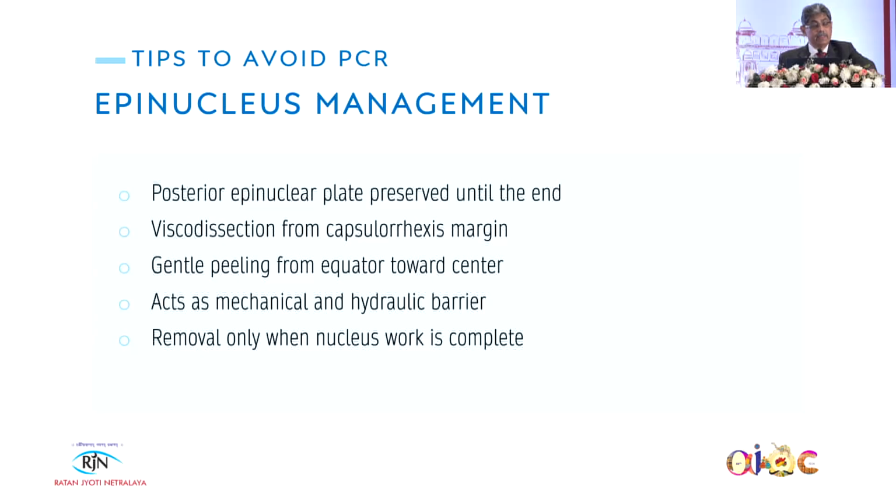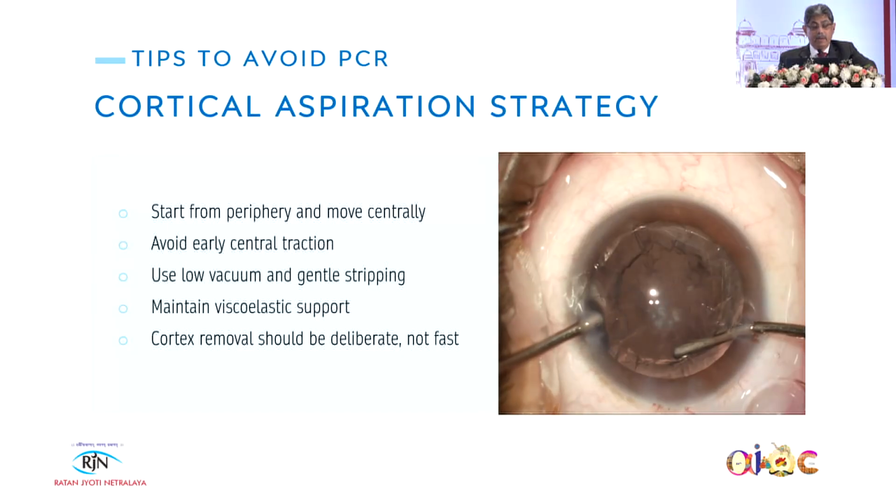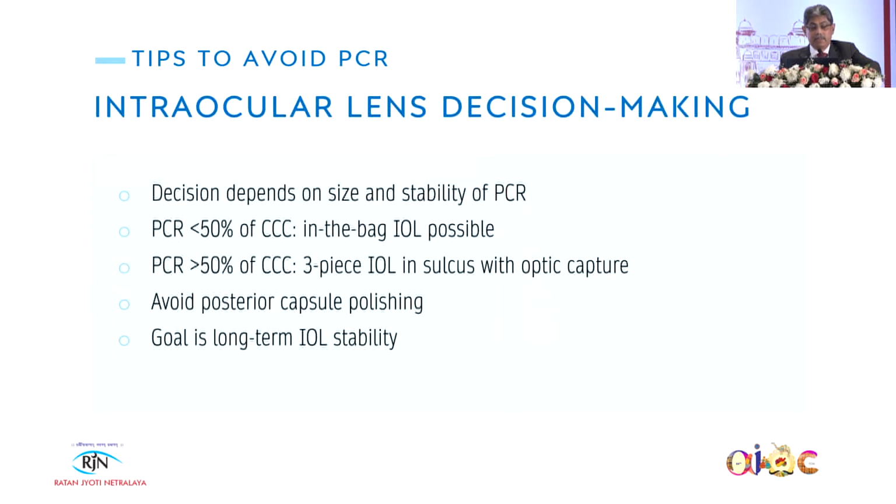Viscodissection could be done, or you can use the iris spatula and release the adhesions of the epinucleus plate, and you can bring it to the anterior chamber. Cortical aspiration should be done from the periphery, and the central part, which is the area of moth-eaten appearance, should never be touched. Maybe you can touch it after you have implanted the lens.